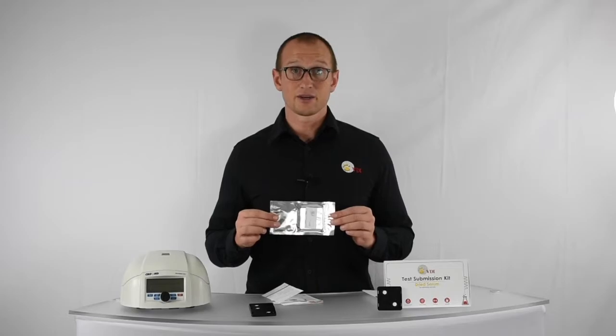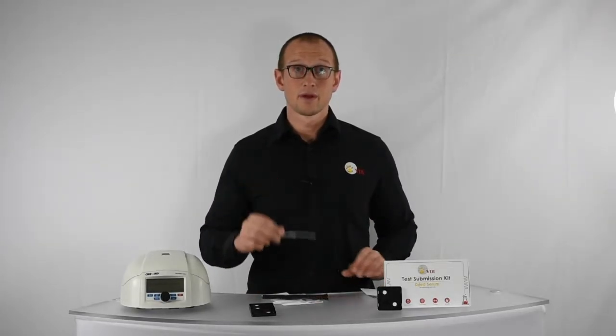Inside the kit you'll find the following components: directions for use, either a test requisition form or patient information card, a foil bag containing the dried serum device, a fixed volume pipette, and a return envelope.